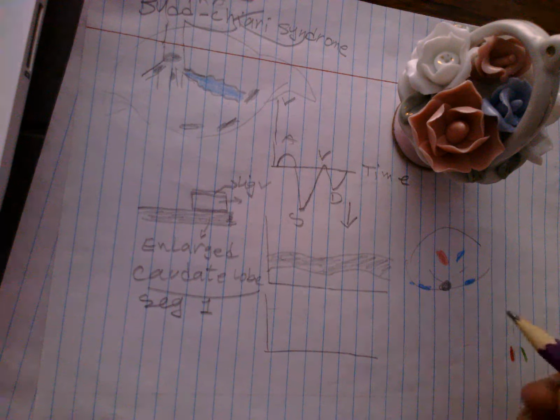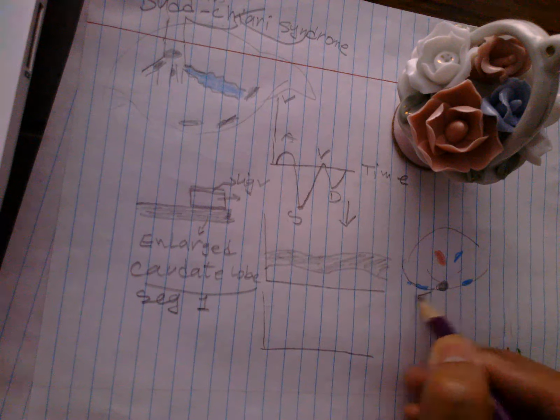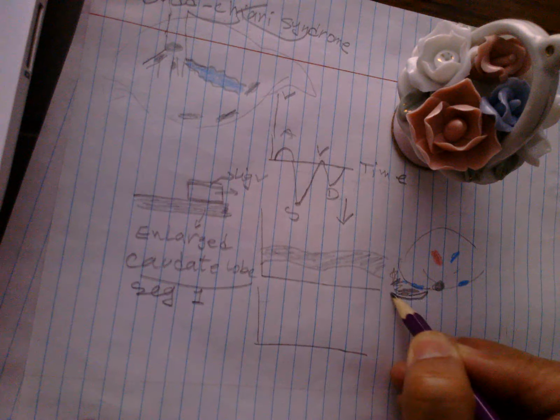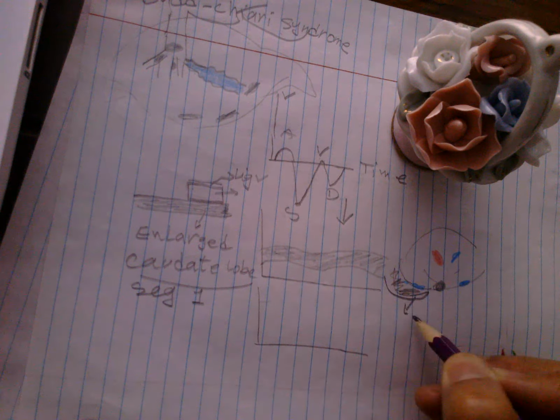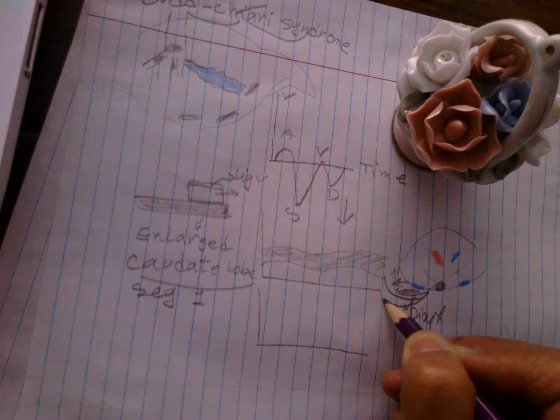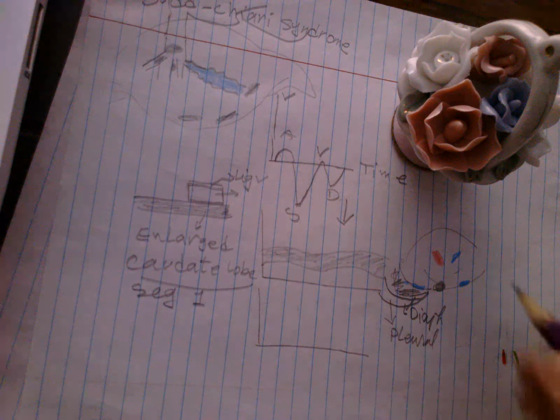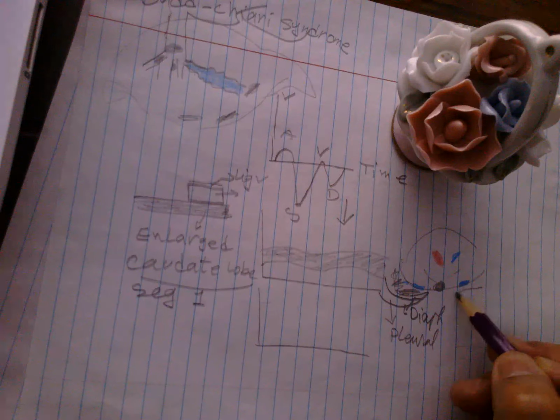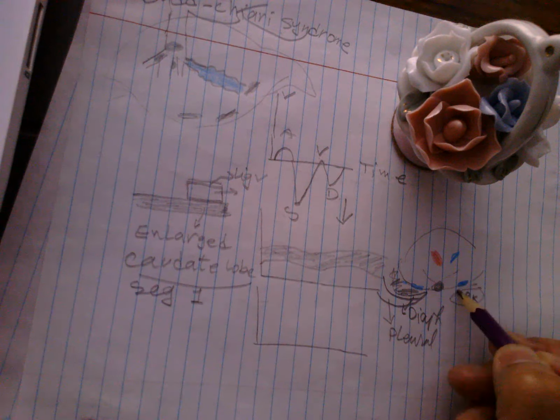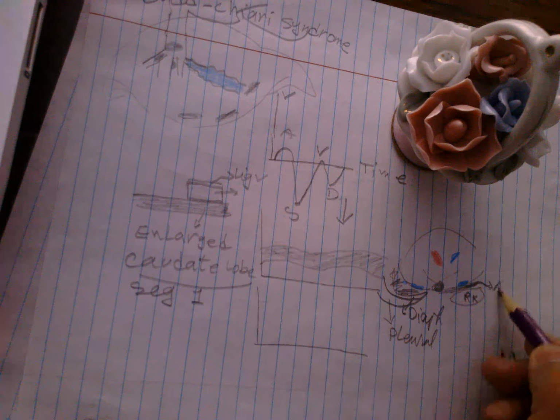Okay, and then here we have ascites, and here we have the diaphragm. We even have pleural effusion, maybe. And if it is the right kidney in Morrison pouch, we have ascites.